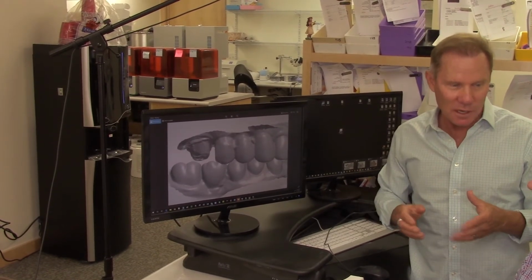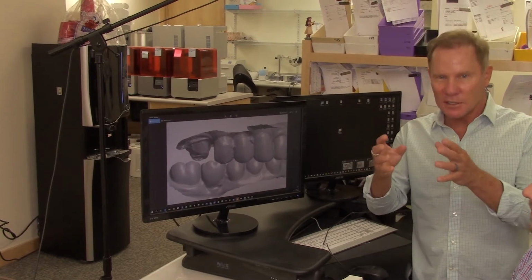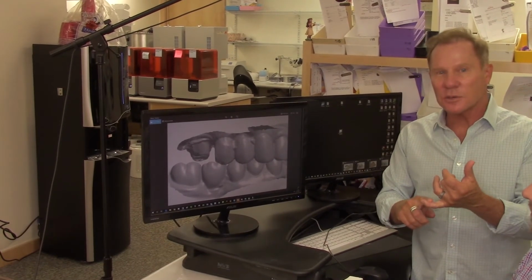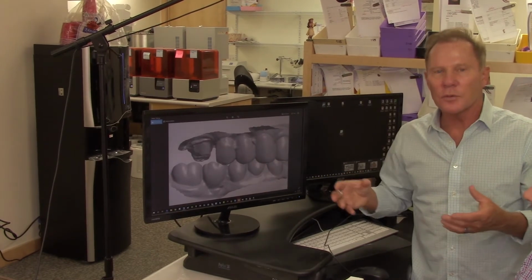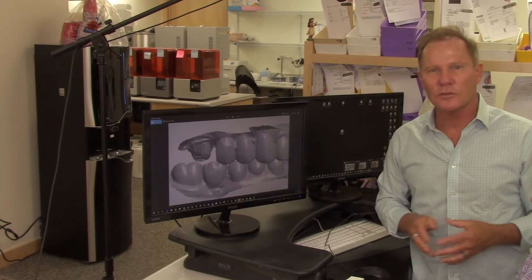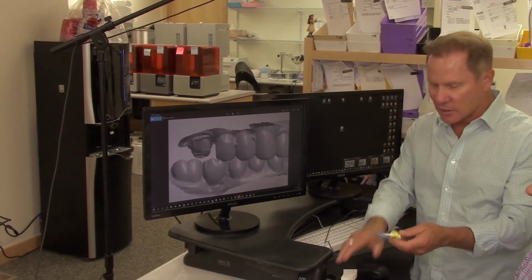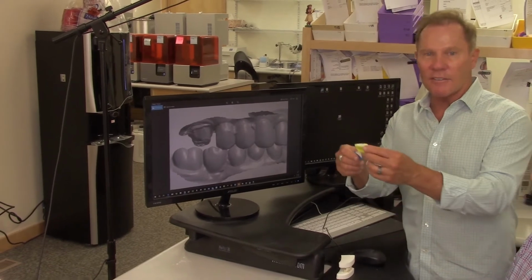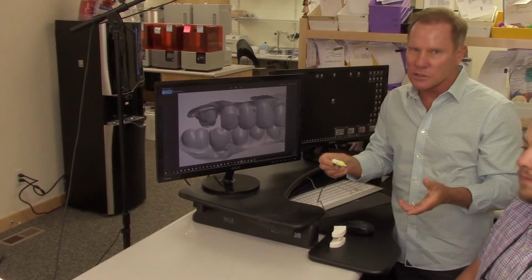Would you agree with me on that? Yep. I mean, we're seeing doctors, and there's even some good studies on that, we're getting up to 60% less occlusal reduction when it's digital. And again, we could print a model, but why do you want a little plastic model when you can save $25? So, you know, we've all had a scenario like this, and I am not an advocate of plastic triple trays for final restoration, but we see it all the time.